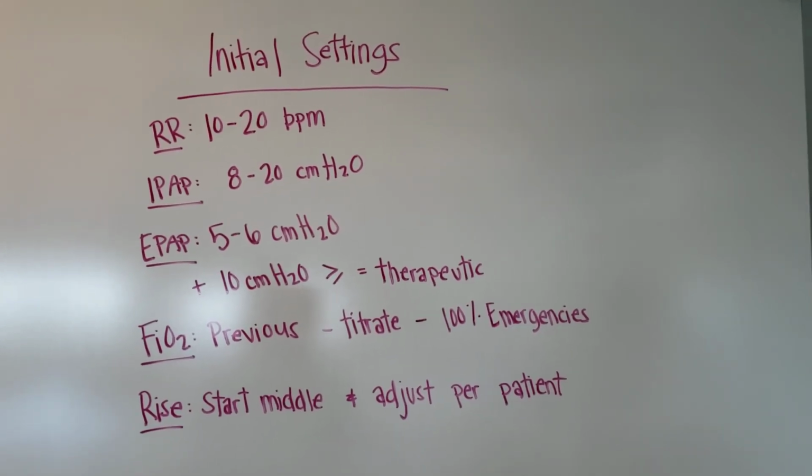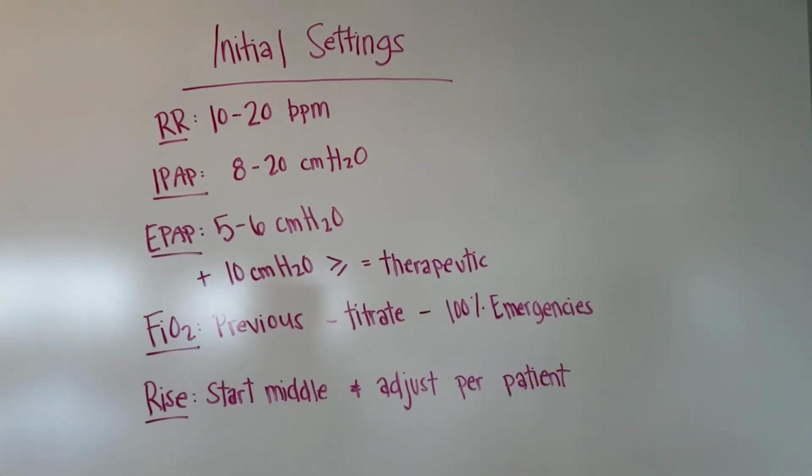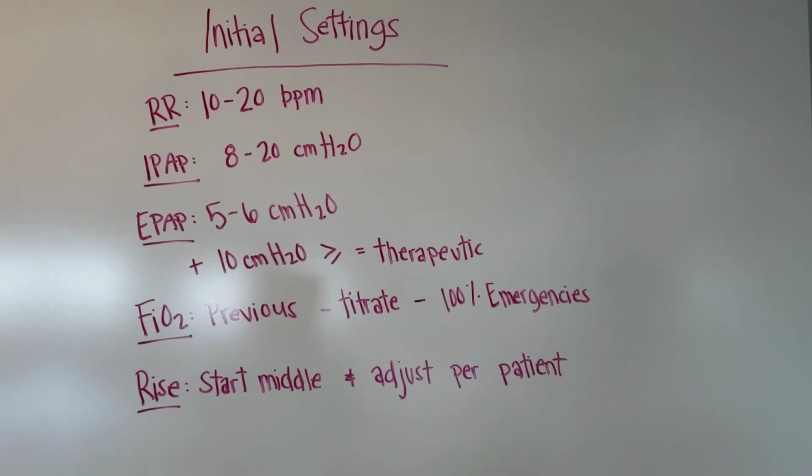You can also administer medications through it, and I will show you all that when I show you the V60 video.